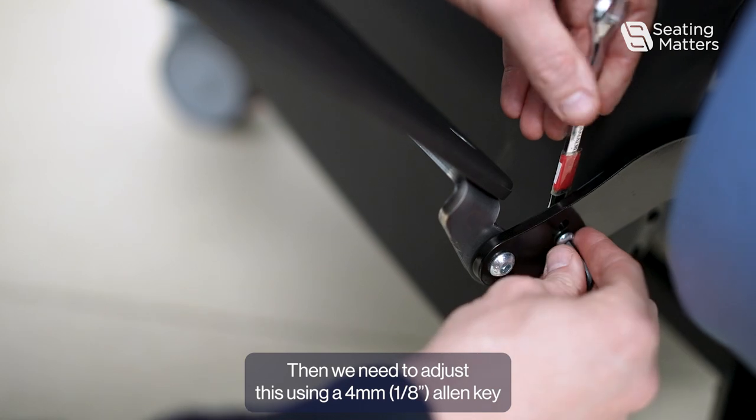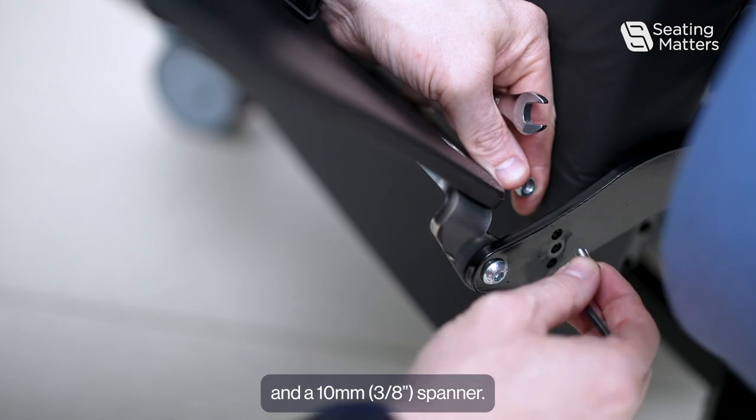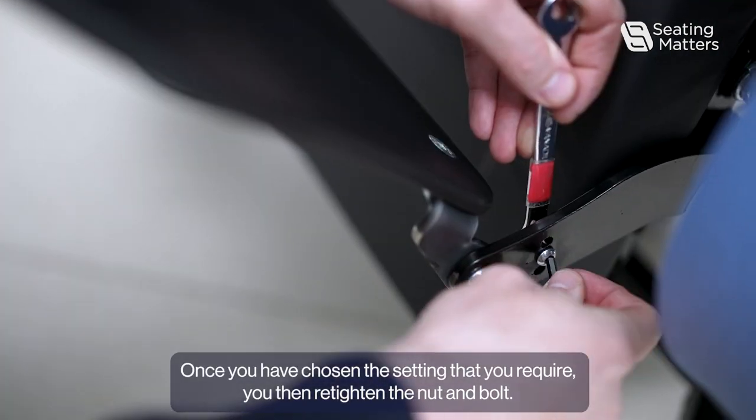We need to adjust this using a 4mm Allen key and a 10mm spanner. Once you have chosen the setting that you require, you then re-tighten and lock the bolt.